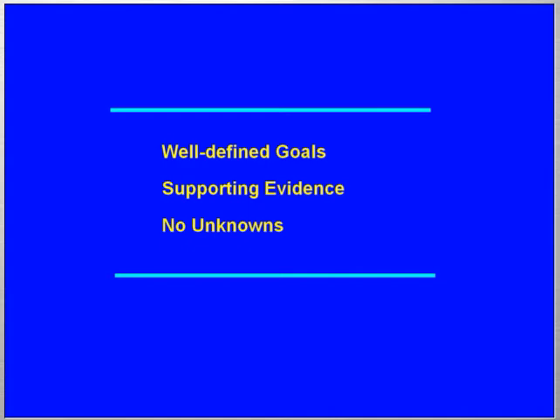Short answer is I don't know. I mean, I don't think we know that. I don't either. I was hoping you were going to help me. Because the long answer is that that's why the last slide ended up by saying that we need to find out what these goals are. Because if we have a complex neural network that's running the ventilator automation, we need to be able to tell it where to go. Yeah, this just seems to be the simple part is telling it when to start and stop. A much more complicated issue to me is figuring what to do during that inspiratory phase. So the level of assist. Right. You don't want to assist all the way because then the muscle will fatigue and will atrophy. At the same time, you don't want to do it under.